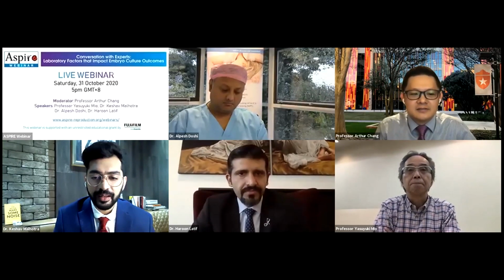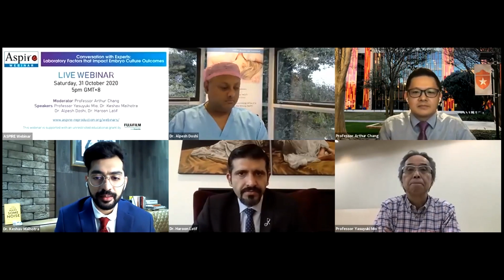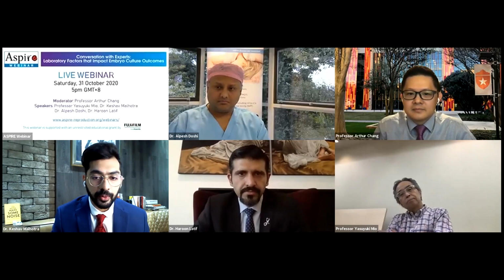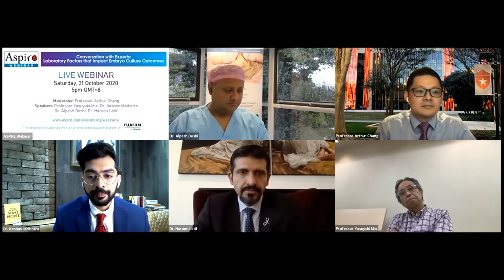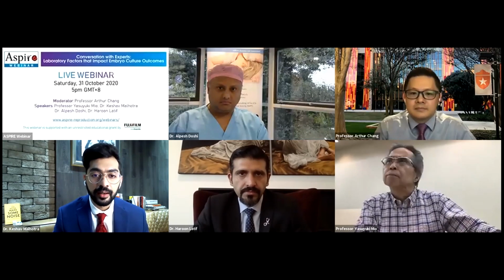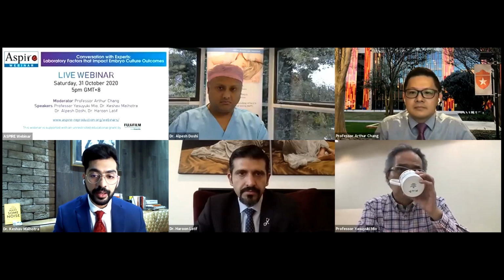Yes. I think the challenge that arises here is that these scoring systems were actually developed at certain culture conditions, which really need to be mimicked in the laboratory, and that's when you would get the same kind of environment. Especially in laboratories where the concentrations might vary, or that are at a higher altitude, in those labs it might be a challenge.